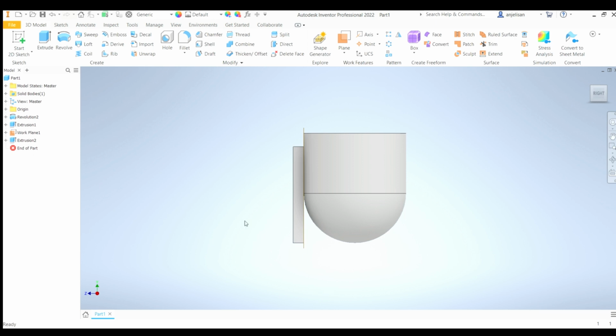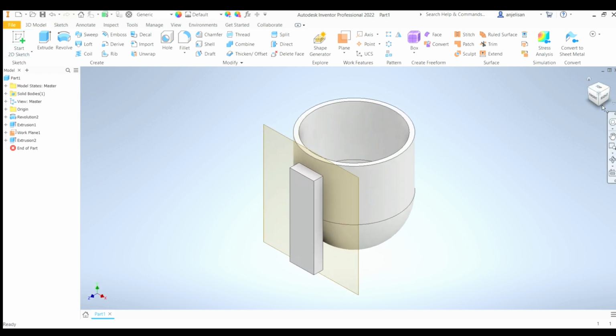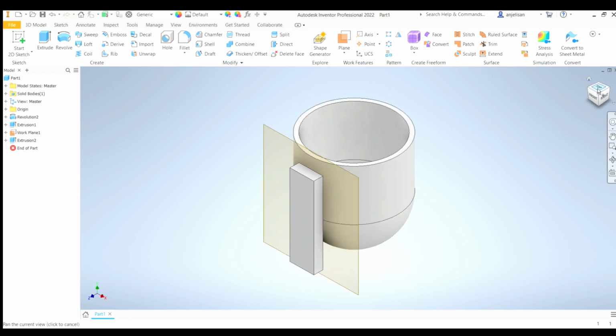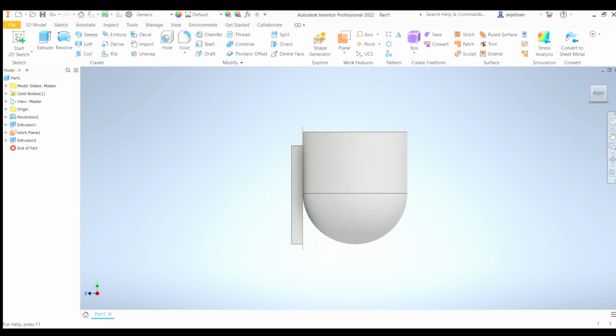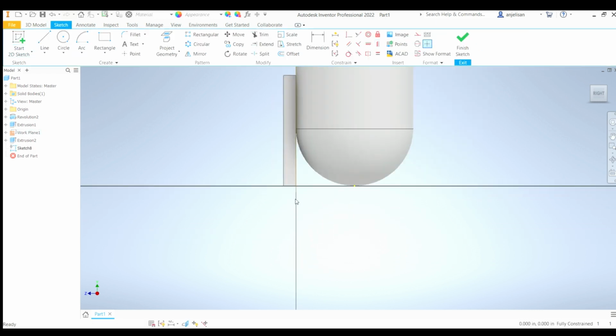Okay, so now we're going to start another 2D sketch, and this is actually gonna be our J shape. So start 2D sketch. Make sure that the camera is facing the side of this rectangular bar. You have this view cube over here, and you can just select the face of the camera that you want. So start your 2D sketch, select this whole face, and then it creates a sketch on that plane.